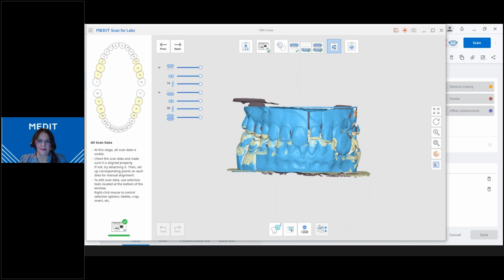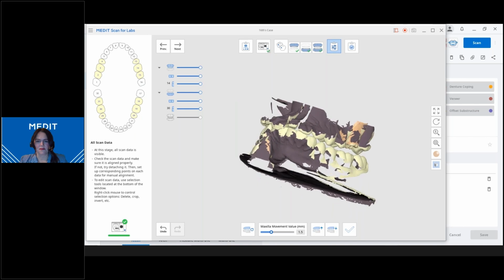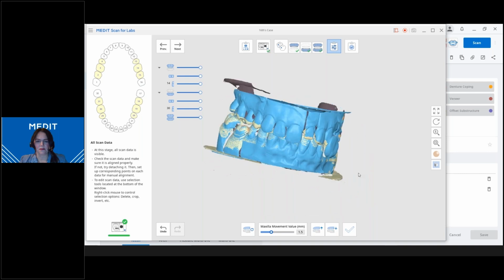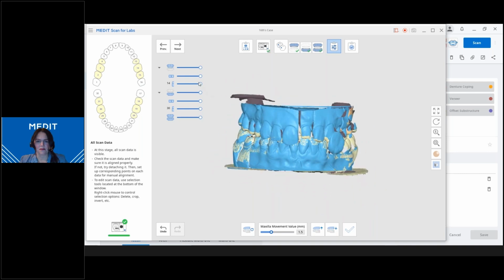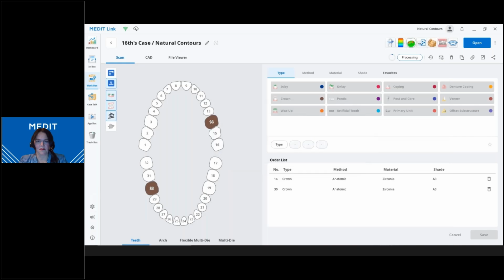If you come down here and click on this adjust occlusal height, you can use this slider, or you can just set it to 2.5, 1.5, whatever you want. And then you can open it up. Normally if the bites were clear, which they're not, you can see the space in here. And then this just closes it back down. Also on the left here, you have sliders where you can turn parts and components of the scans off, so you can individualize your view. Then you would go to next, and you'd be done. And there you are. Very nice.